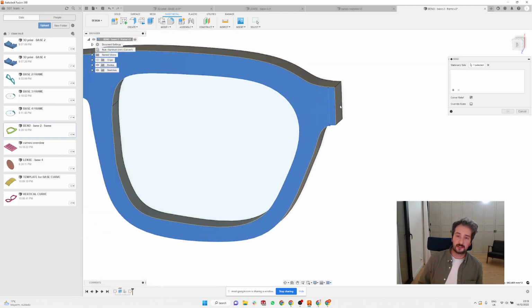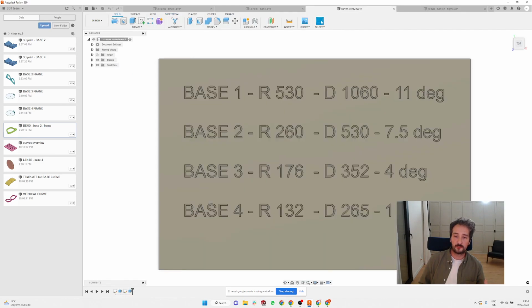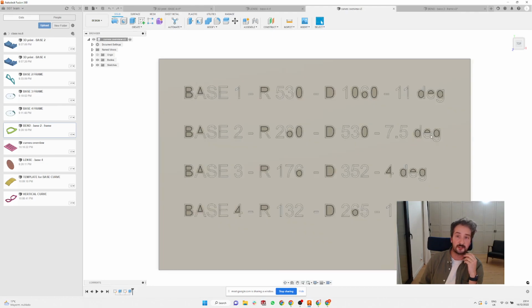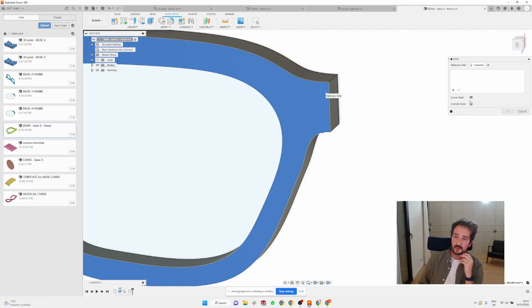Now it's telling me that this little part is stationary, so that one is still going to be straight and without bend, and from that point to the left is going to be bent. And here I can click the override rules and change the bend to the radius of the lenses, which, if you look here, for base 4 lenses is a radius of 132 millimeters. So I'm going to, sorry, I need to do it again. I'm going to go to Bend, click on this small bit here, click override, bend override, and plus 132.